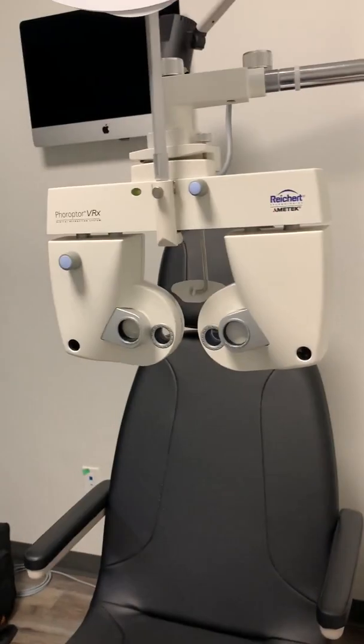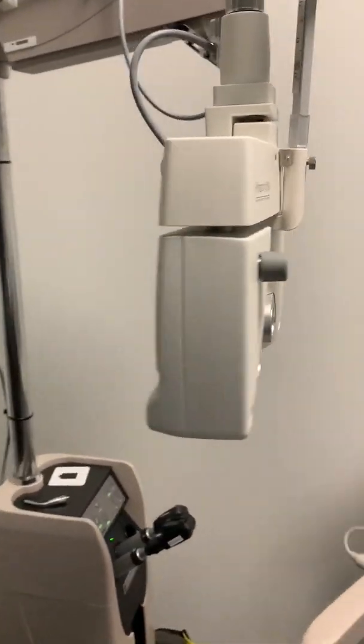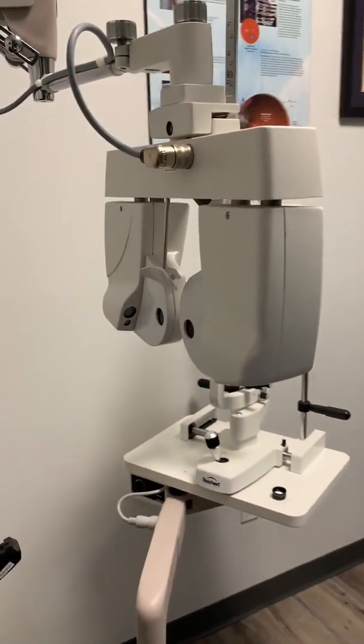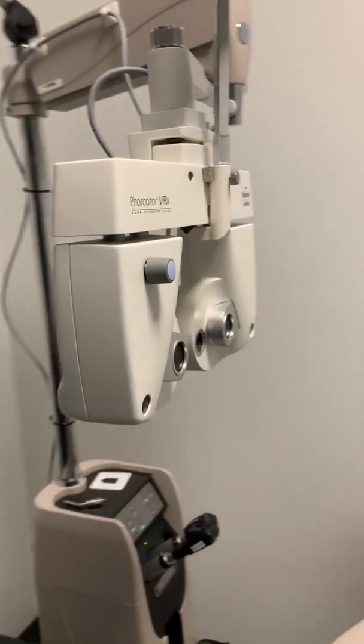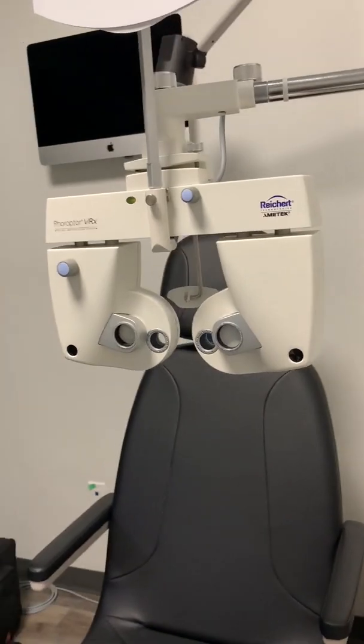The phoropter is the piece of machinery that leads us to a patient's prescription. This is the wonderful machine that we get to ask people one or two when we use. It allows us to determine the best lens for that person. Most phoropters you'll see have dials on the side and are black and silver in color. Ours at the clinic are automatic, so there's a control panel that I use to adjust what lenses the patient is looking through. However, they're both capable of providing an accurate prescription.